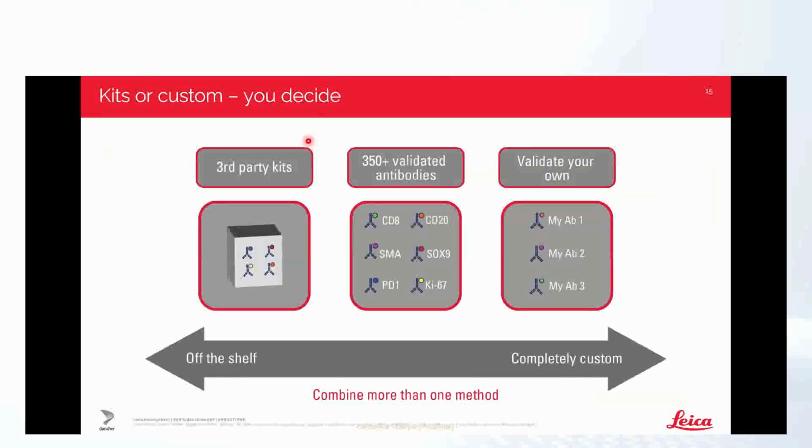Also, this instrument is agnostic to what you're going to attach these fluorophores to. So we have groups that are doing RNAscope and Molecular Instruments type of staining for what is happening with the transcriptome in addition to the protein. We have groups looking at post-translational modification using lectins for binding their cells with these fluorophores, and you can cycle these different colors on, off, on, off. It doesn't matter what they're attached to.